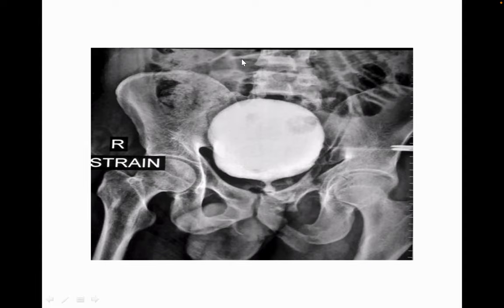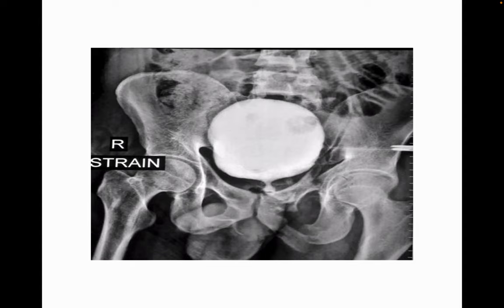The commonest type of injury is Type 3, which is an inframontane type of injury occurring at the level of the pelvic floor. Most patients with this type of injury, when they void, will show the prostatic urethra a little dilated and you will probably see the verumontanum as a filling defect. In this particular case, if you look carefully, you see two shoulders — at the bladder neck and another shoulder — then an abrupt cut-off.